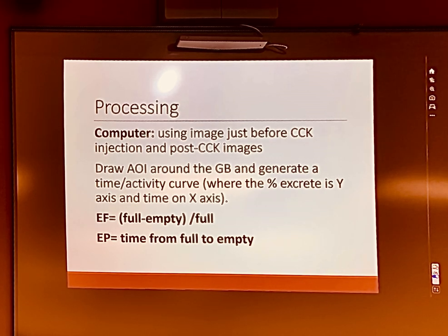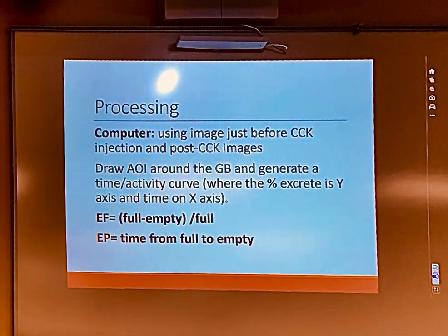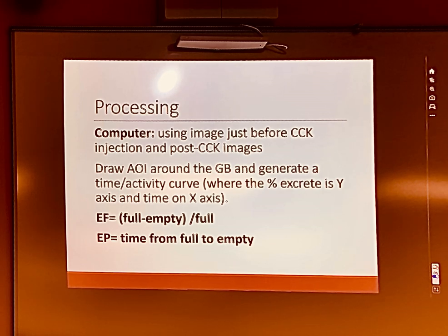I recommend to everybody, and I make my techs do it still, and it drives them bonkers, but it saved their bacon the other day. Always, even if you're doing a dynamic HIDA scan, take a pre-CCK picture, and it's 1 minute. We do a 1 minute pre, and then we let it run for an hour, and then we do a 1 minute post. So we do the regular HIDA, we see everything, we take a 1 minute static, then we run the CCK, and then we do a 1 minute static at the end.